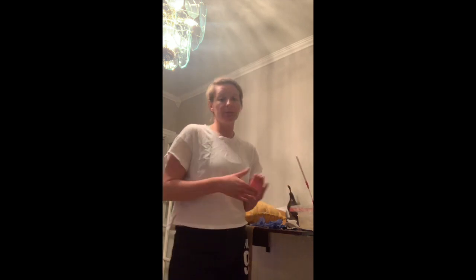This is now my tubing and this is now my bag. I filled up my bag with a thousand milliliters of tap water before I even entered the room today.